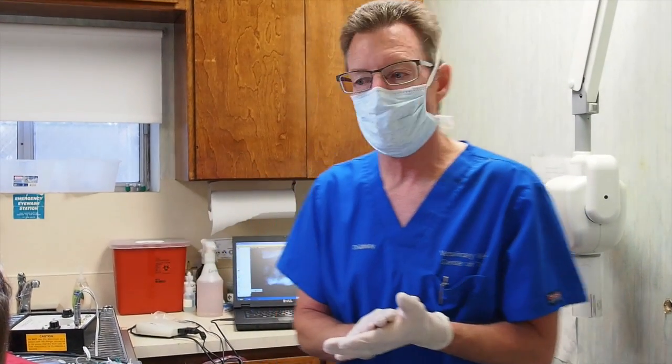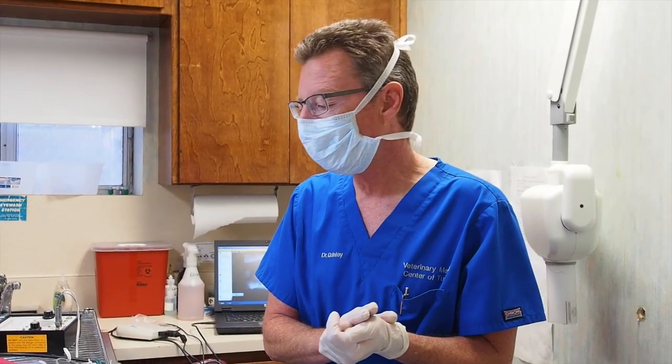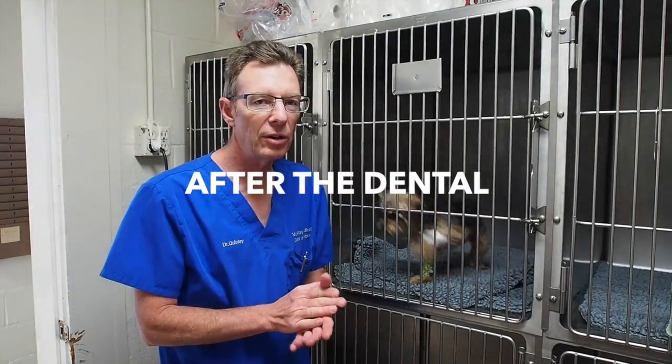So the next step, I'll show Jasper after he's awake. With the anesthesia we use, he'll be up and around, probably ready to go home within an hour or so, looking pretty well. I also do nerve blocks if we do anything that's painful to the teeth, any periodontal surgery, any extractions. That way they aren't having any pain sensation when they go home. It does wear off eventually, of course. It also allows us, when there's no pain sensation, to keep the anesthesia much lower, and that's much safer for your pet.